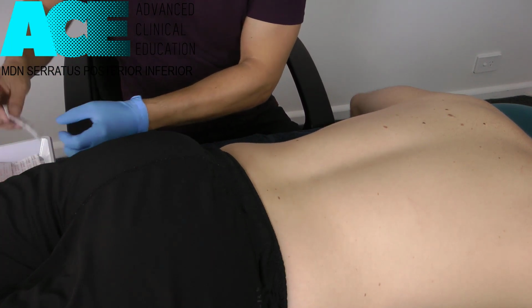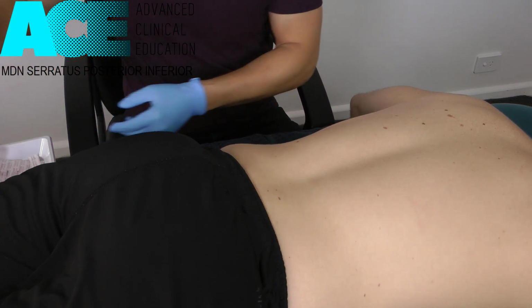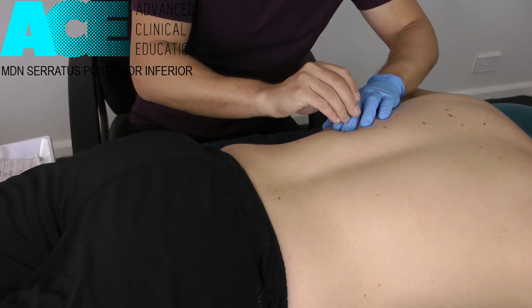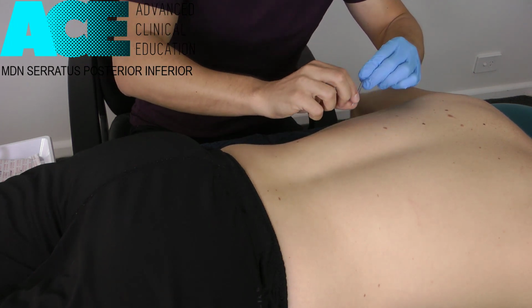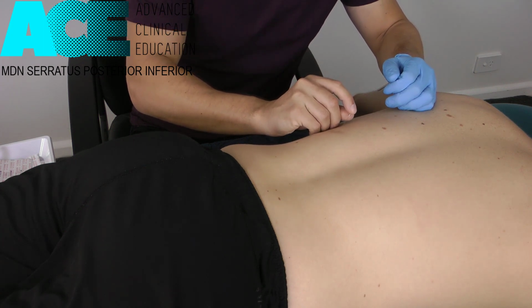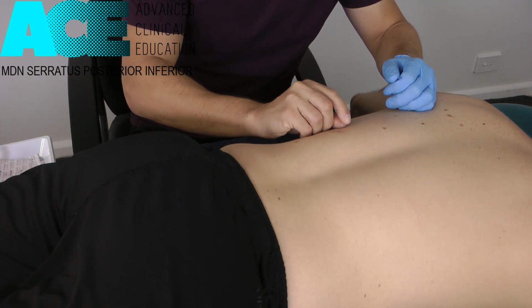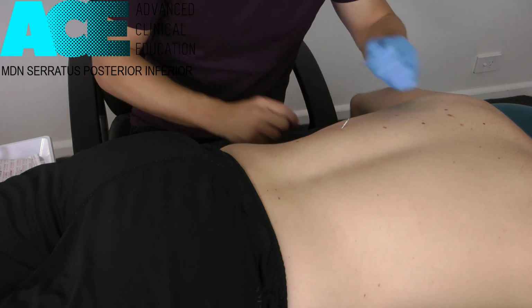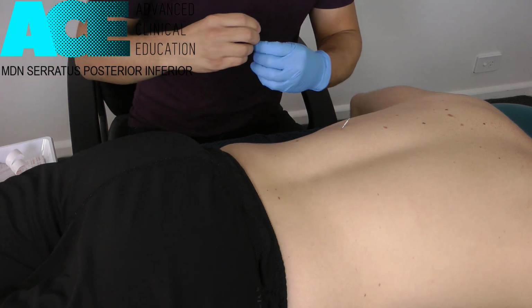Needle size 40 to 50 millimeters in length is plenty. We're going to palpate down to that rib. We insert the needle following the angle of the fibers of that muscle. Insert that needle, making sure that we're staying superior or superficial to the level of those ribs, angling down into those muscle fibers. You're going to pass through a number of other different tissues here to get to Serratus Posterior Inferior. That's okay. We'll put a couple of needles in, pick up a couple of different fibres.